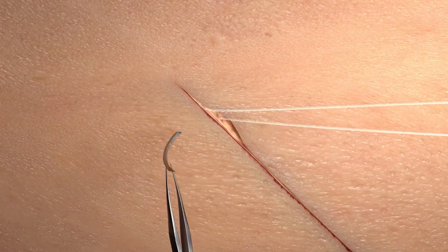Once the apex of the incision is reached, simply exit lateral to the incision coming out of the superficial skin and then cut flush.